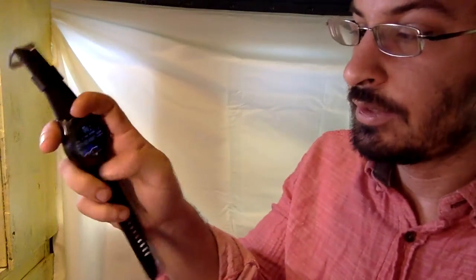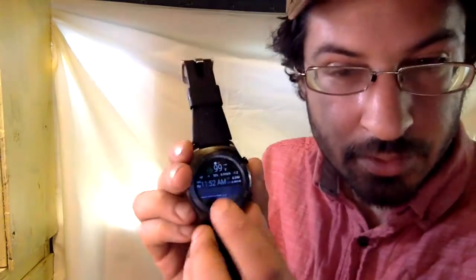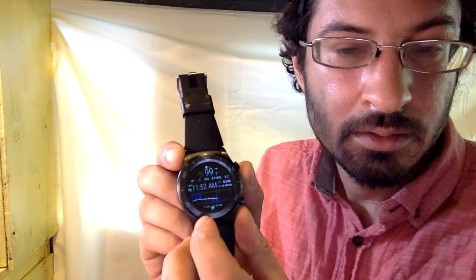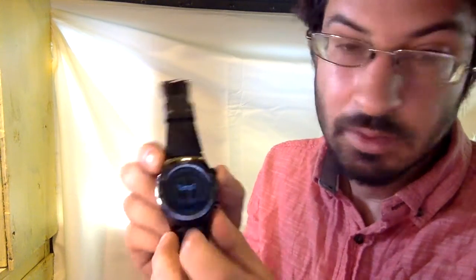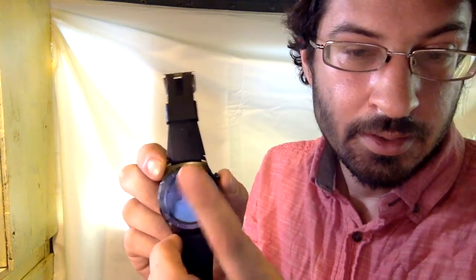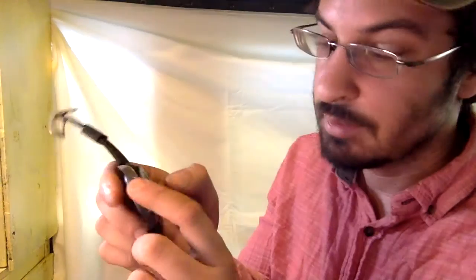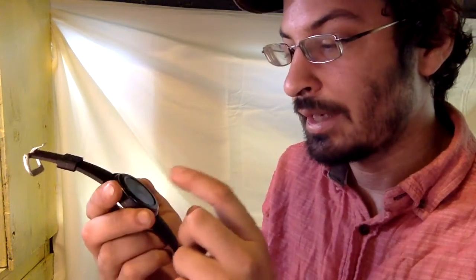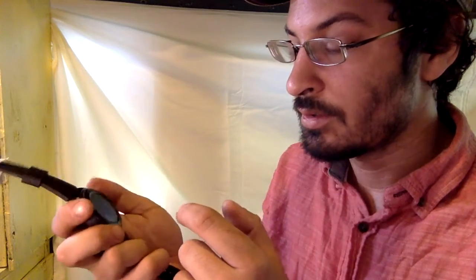So there's a couple features for how to use this. If I double-click the graph, it changes the time that's displayed. And if I double-click the top half, I go to this. And so I can set a temporary target, I can bolus. Most reasonably, you'd want to use the wizard, enter your carbs, and it will start calculating for you.